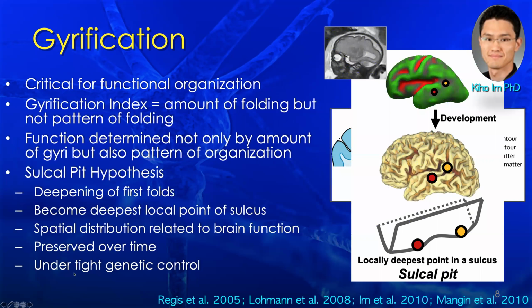So looking at each of these sulcal pits, we look at the depth, the position in 3D space, the geometric relationships to other areas of sulcal basins that are around these sulcal pits, and calculate the area also of these basins. And then again, using these spectral matching techniques, we can compute a similarity index, which allows us to compare sulcal pattern and quantify the similarity of gyral folding between different brains, either between an individual and template of normal or between different individuals.